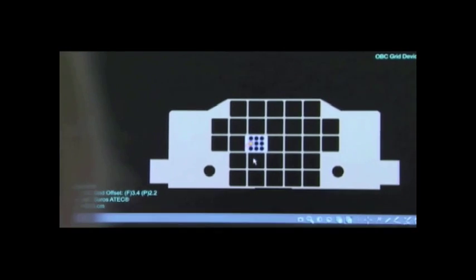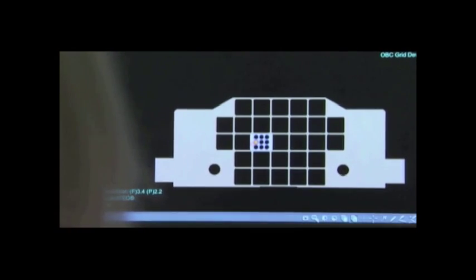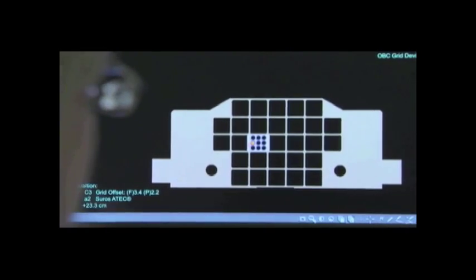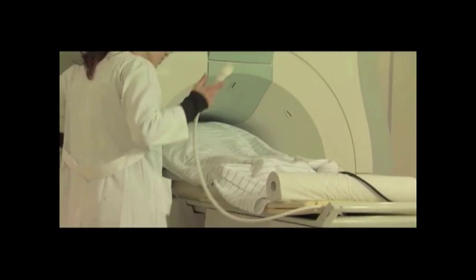Print a paper copy of the target location image or record target coordinates on the manual grid worksheet. Shuttle the patient out of the magnet.